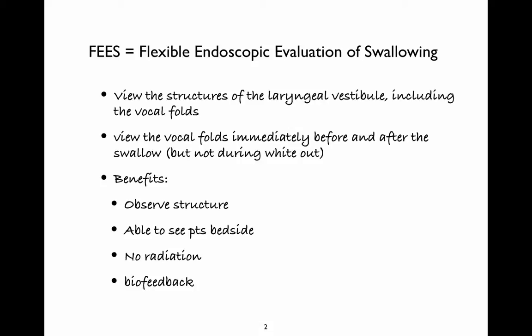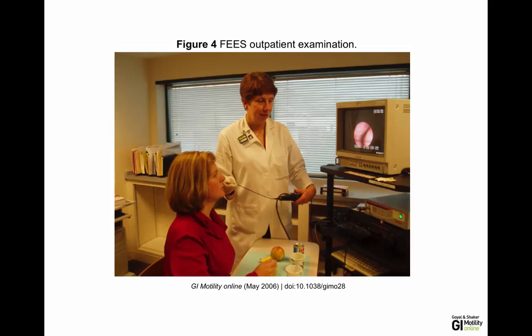There's no radiation using FEES, and because it's portable and it does not usually damage any structures, it actually can be used as a visual form of biofeedback when you're working with patients and you're trying to get them to use a particular technique or show them that they've improved or not improved. Let's take a look at what it actually looks like.